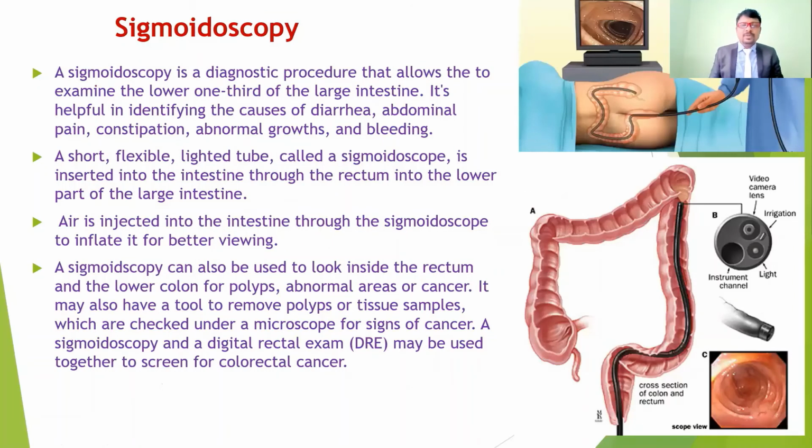So coming to the sigmoidoscopy, if anybody has any problem in the lower digestive tract, such as the colon, rectum, or sigmoid colon, this is used.